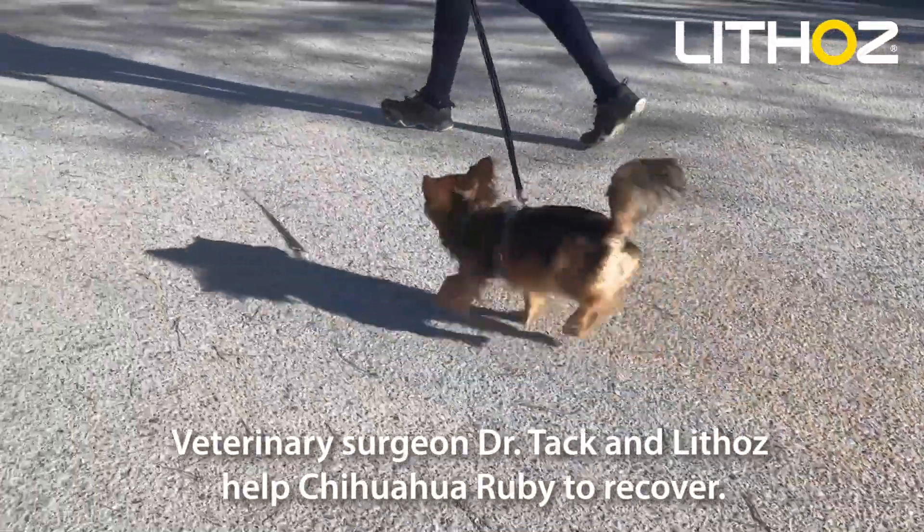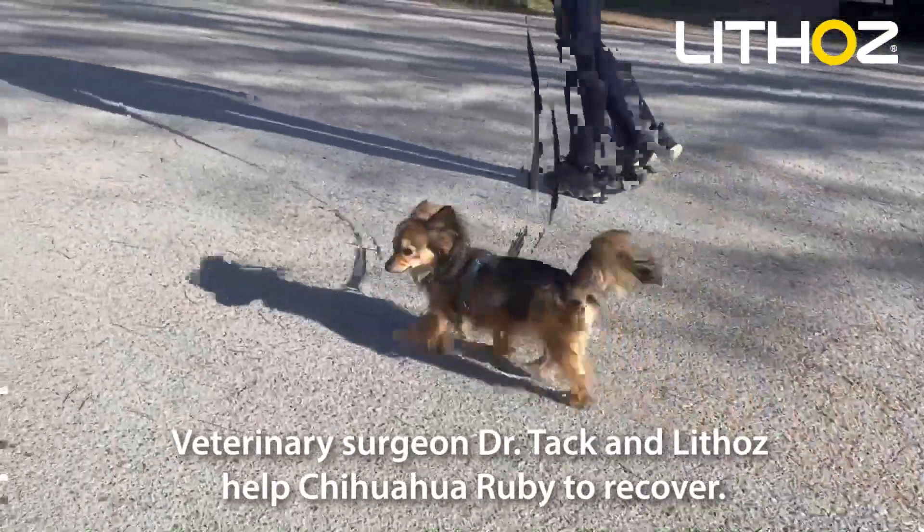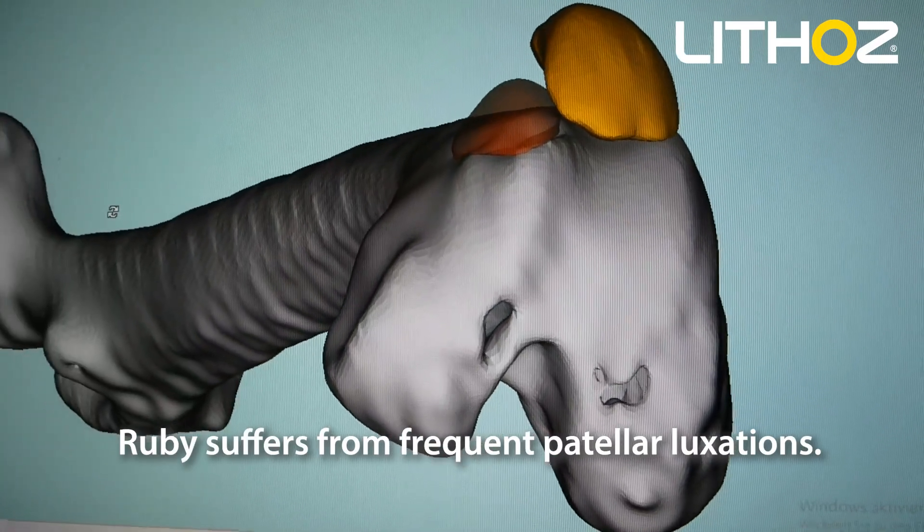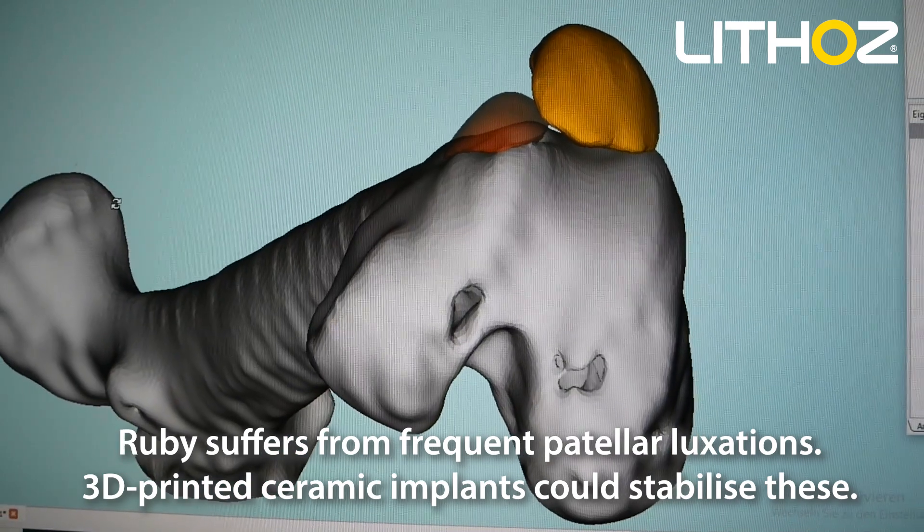Veterinary surgeon Dr. Tack and Lithoz help Chihuahua Ruby to recover. Ruby suffers from frequent patellar luxations. 3D printed ceramic implants could stabilize these.